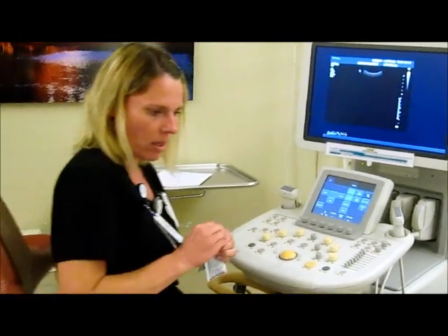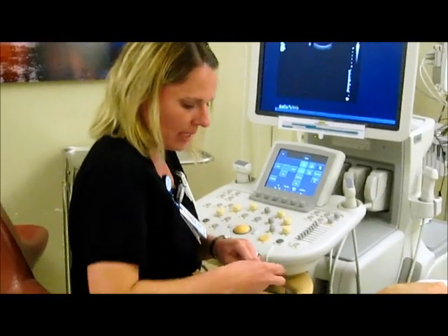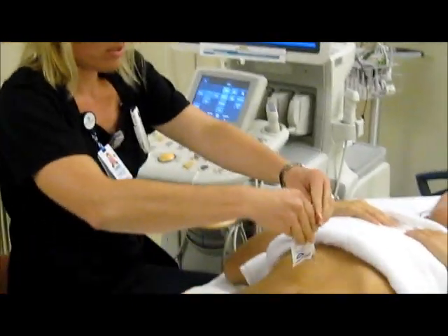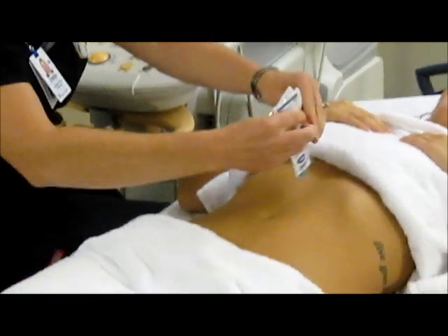So, you can put a little bit of gel on her skin. The gel gets all of the air off the tissues. Air and ultrasound do not like each other. It's going to be warm.